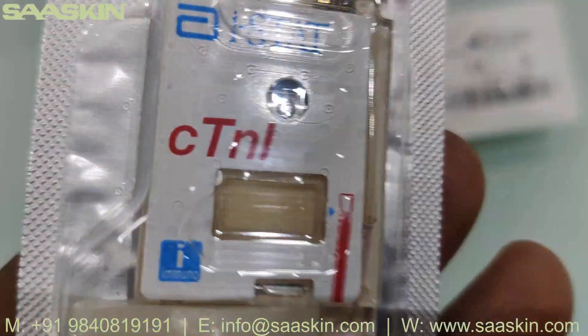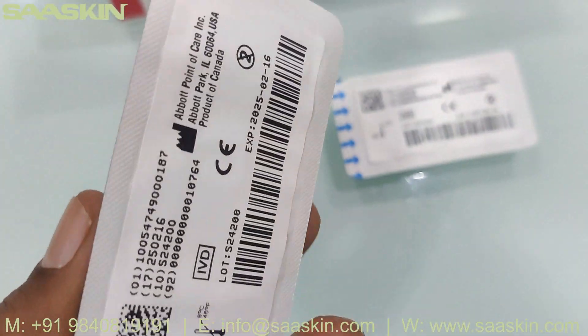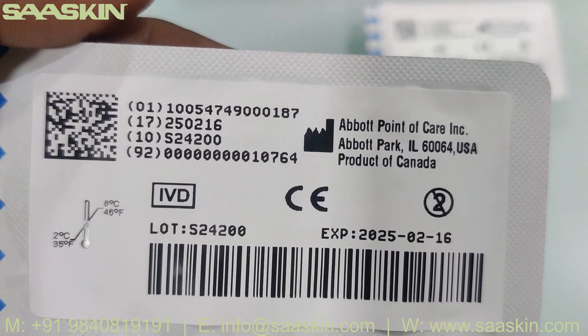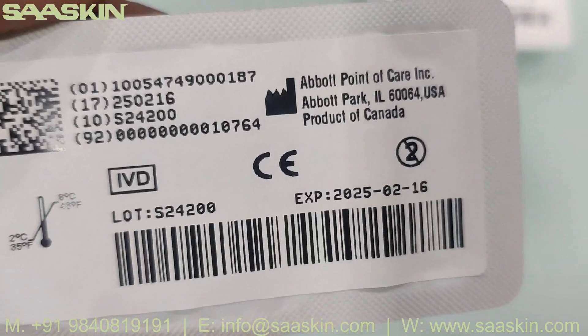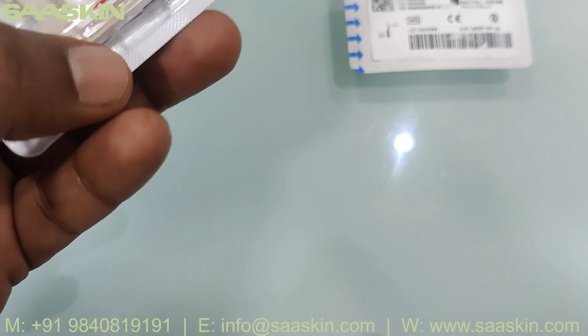You can see the iStat C-10L — it is nicely packed. Once it is sealed you can even keep it at room temperature for five days, so it's safe. You can see the expiry date is given, the certification, the lot number, and storage location information on the other side.